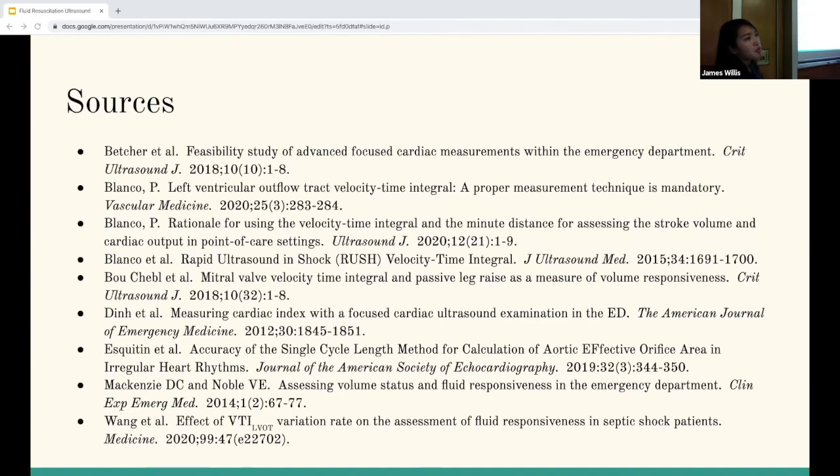increases, because the heart rate would be more rapid to begin with because of the volume depletion. Right. Response, like contractility. And then as we get more volume, they relax. So how do you control VTI for changes in the heart rate? Let's see. The change, I don't think it would matter because it's not at that level. It's not looking at that.